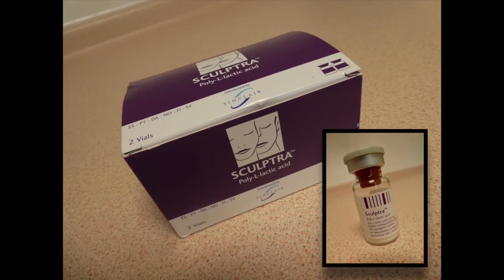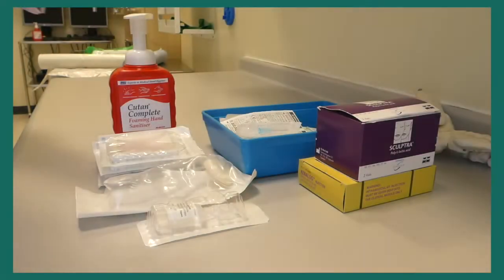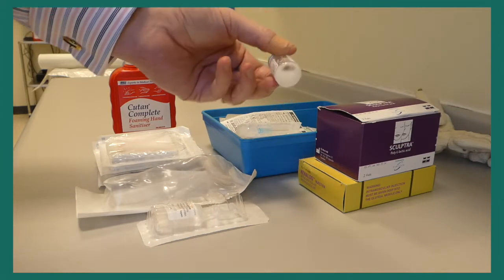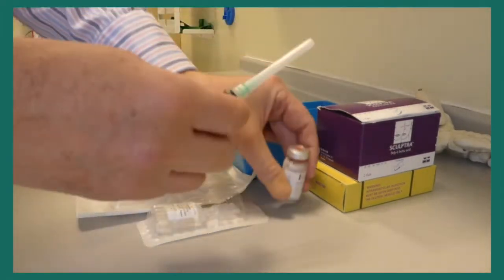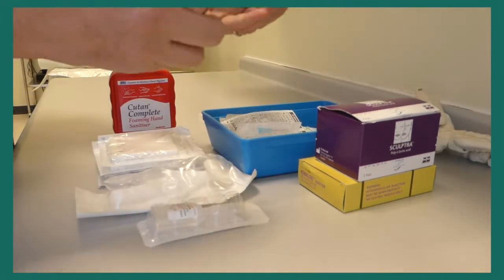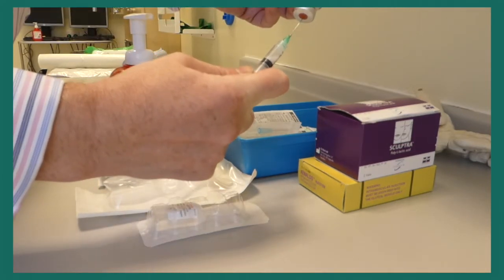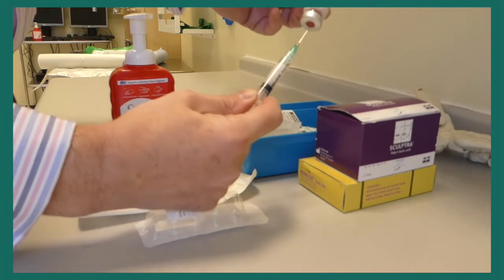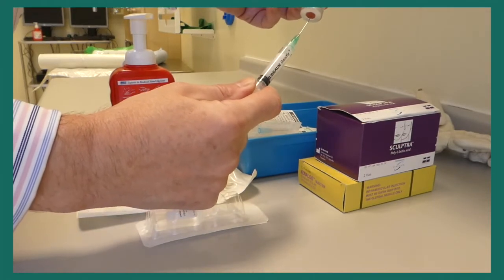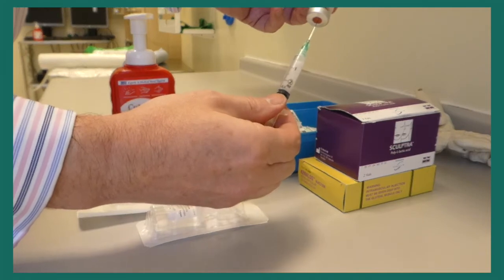This is the injectate that we need to make up with sterile saline or sometimes local anaesthetic, at least two hours before. Today we draw up our Sculptra — this has been sat with local anaesthetic for six days, it needs time to cure. I'm going to draw up with a green needle, put a little bit of air in, and you can see it's just a little bit goopy. We'll draw up about two and a half mils, which is a nice amount for this particular foot.